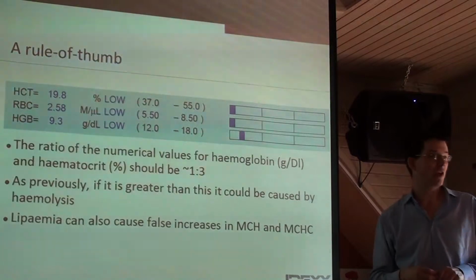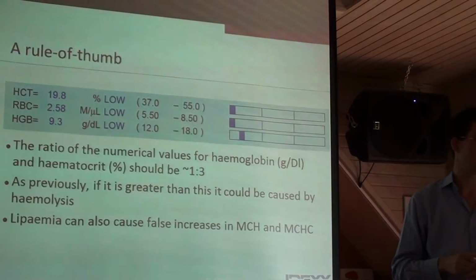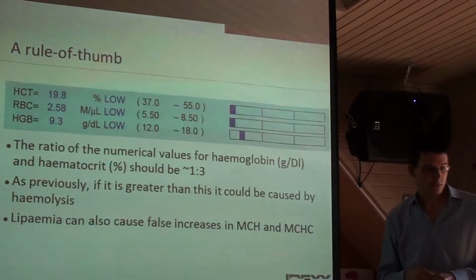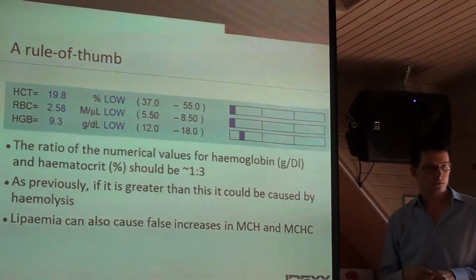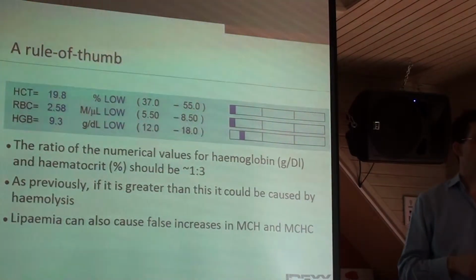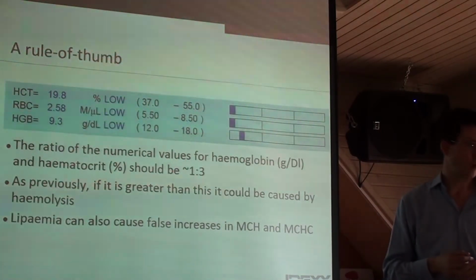So we know that we have lost very approximately 7 percentage points of the red blood cells. Ja siin selles konkreetses on siis näha, et umbes 7% punkti võrra on kaotatud need punased vereliblesid. And if you've broken that many red blood cells, you've probably also broken some white blood cells.